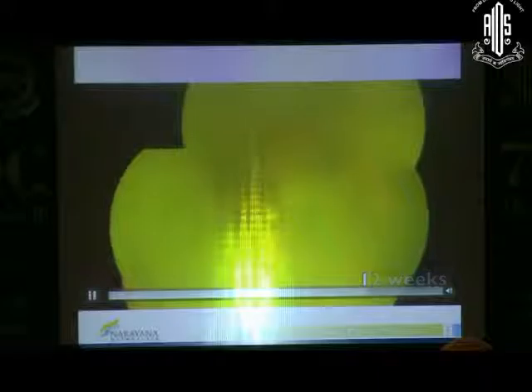We should have lasered it at that time, but the child misses follow-up. You can see the hemorrhage superiorly, and then it's lasered. So 12 weeks after injection. So this is important. You monitor this. It's only then you can pick up these early changes. This child does well because of then adding on this laser.